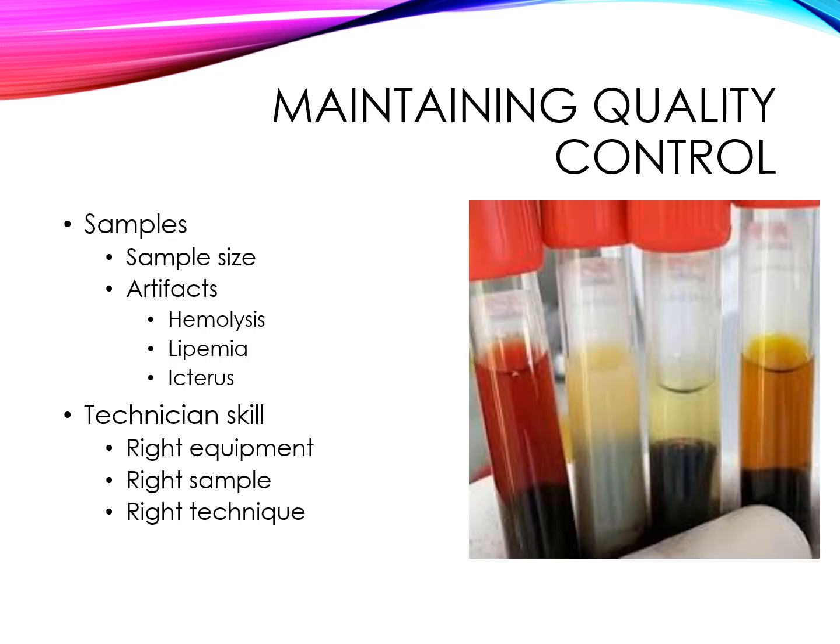Another thing to consider is the actual sample quality that you are putting into the machine for the test. If the sample is not large enough for the requested amount from the machine to run the test, it may suck it all up and then suck up air, which will mess up the test and probably prevent it from running the blood at all. It may error out.